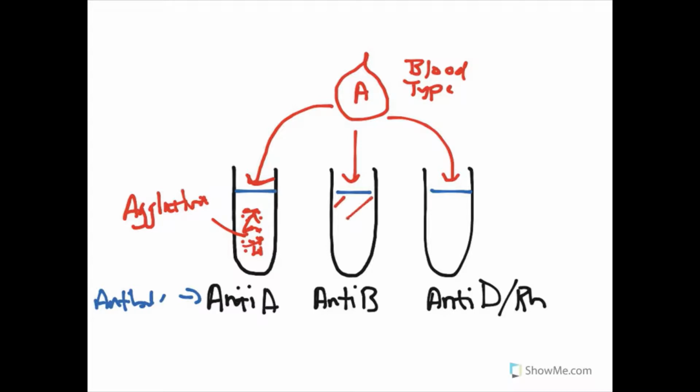Now, here, anti-B, it will just dissolve in it. That's it. There's no problems. It mixes. It's not going to clump. Now, if we said this was a positive blood, and I put it in anti-D, it would also agglutinate. Okay? So I'm going to try to visibly make this a little bit more obvious that the blood is mixing by drawing it more like this, and say this is when it mixes. Nice kind of crosshatch here that it's mixed in it. And I'll draw clumps that it agglutinates. Okay? So let's look at this.